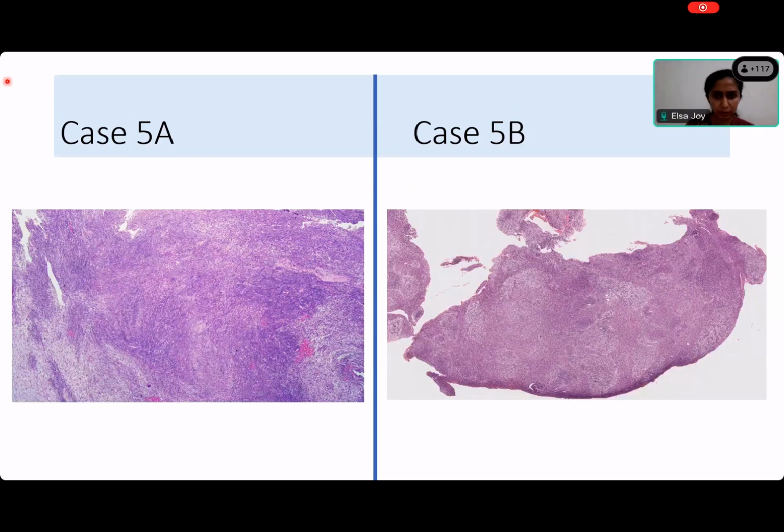Ma'am, both are cellular tumors. Very good. 5A is more basophilic. Yeah, but that's a staining artifact, no? 5B is partially circumscribed. Well, we don't know. It's just a fragment of tissue, right? But they're very cellular. Yes, both of the tumors are cellular. There may be some areas where they're less cellular than in others. All right. Now that's 5A and these are 5B.